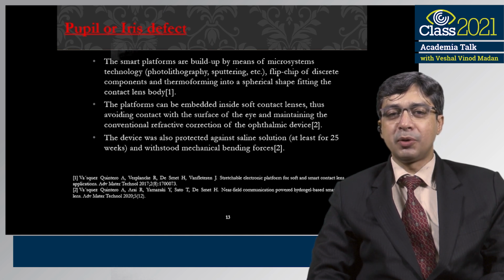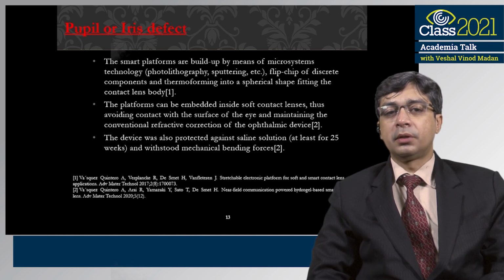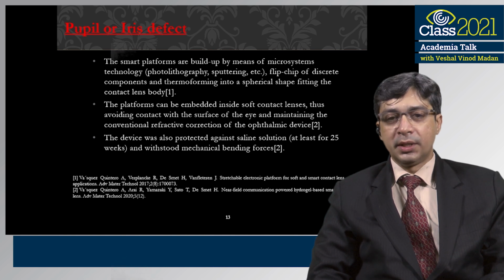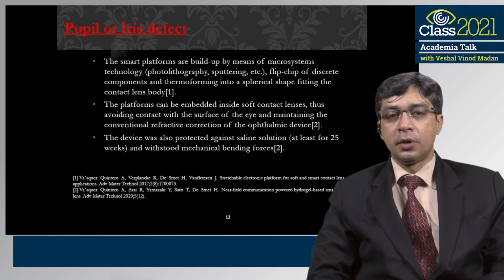Pupil and iris defects can also be addressed, and this kind of lens is very commonly used for people with special ocular needs, where they need cosmesis as well as prevention of other clinical conditions which can be aggravated by these pupil and iris defects. There are a lot of contact lenses already being used as prosthetic lenses, but furthermore, these can also help in dry eye management.